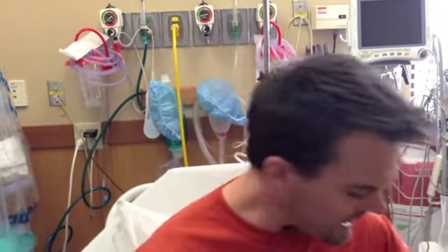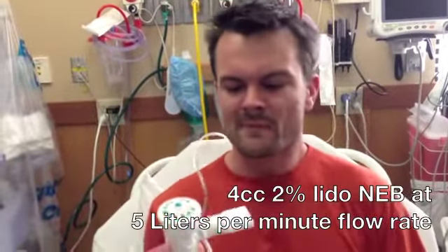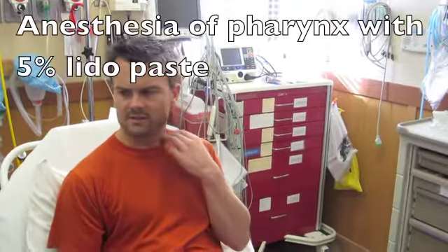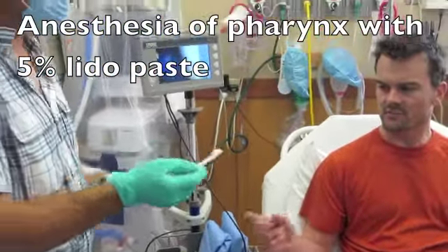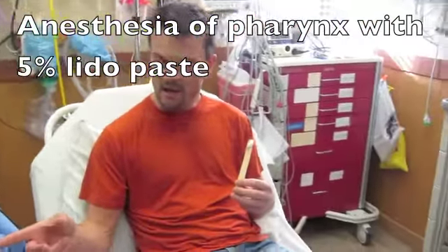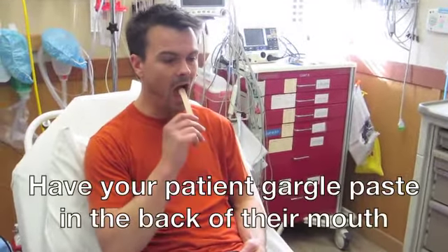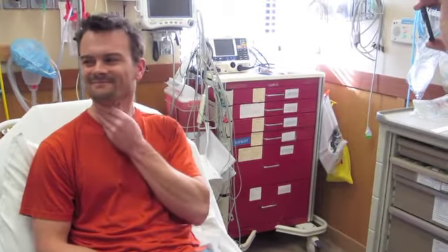A little bit sour. Okay, and the second thing we're going to do is nebulize 4 cc's. Wow, I can already feel that. 4 cc's of 2% lidocaine without epinephrine. The next thing to do, there's a couple of different ways you can do this. One of the things I like to do is use this 5% lidocaine paste and/or a mucosal atomizing device. But if you take this stuff and just put it on the back of your tongue, I think that's got a good flavor to it actually. Is that flavored? Is it spearmint?